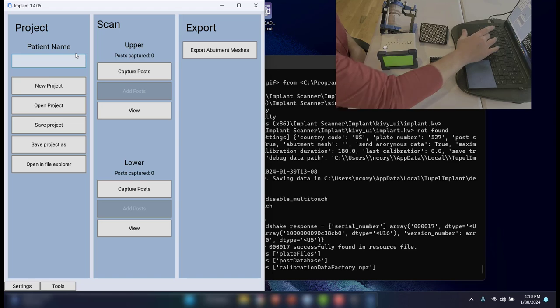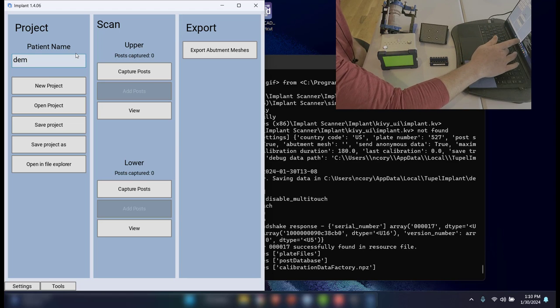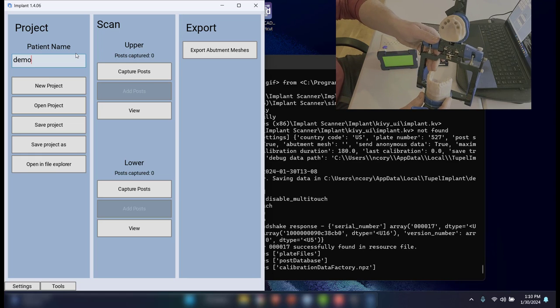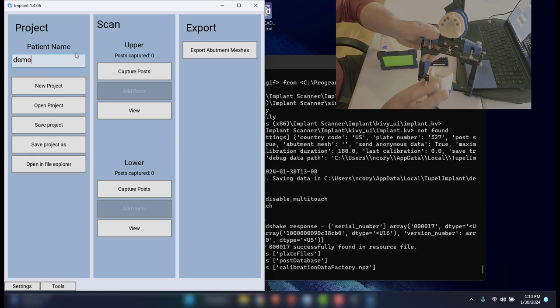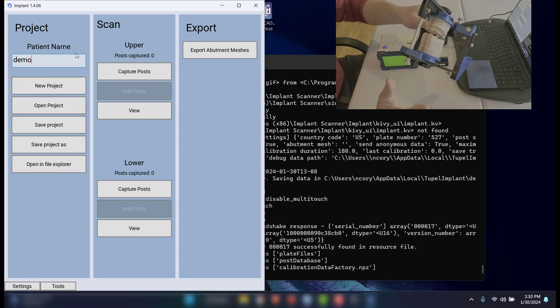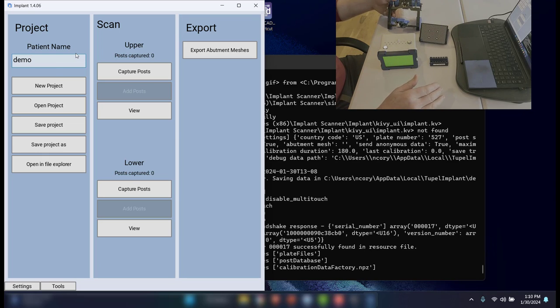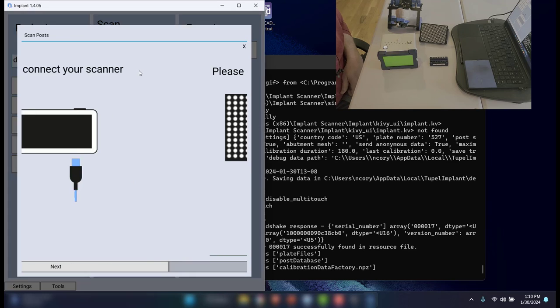I just need to put in the patient info. I'm going to just call this demo. And again, this is an upper all on 5, as you see here, just opposing natural dentition. You're not capturing the bite or anything with the scan. You're just capturing these implant positions on the maxillary arch. All right, so I'm going to go ahead and click capture posts.